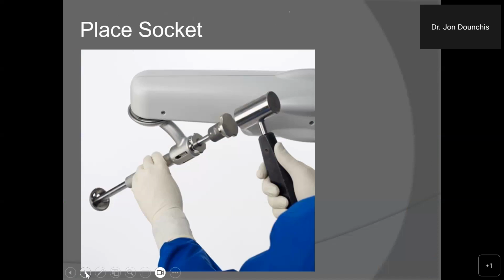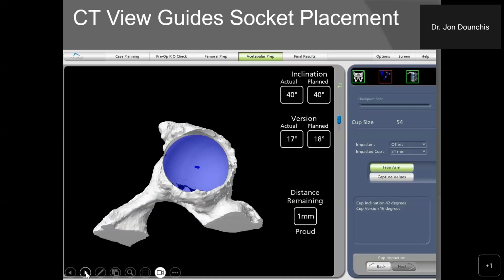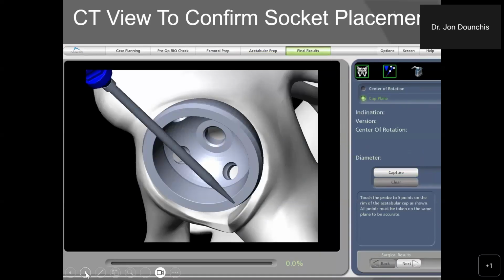And the robot helps guide us with placement of the acetabular component, which is a thin acetabular shell of titanium. Next slide. We'll show some slides at the end. And we can guide exactly the position and orientation of the acetabular component. Next slide. And we check those positions as a secondary check. Next slide.